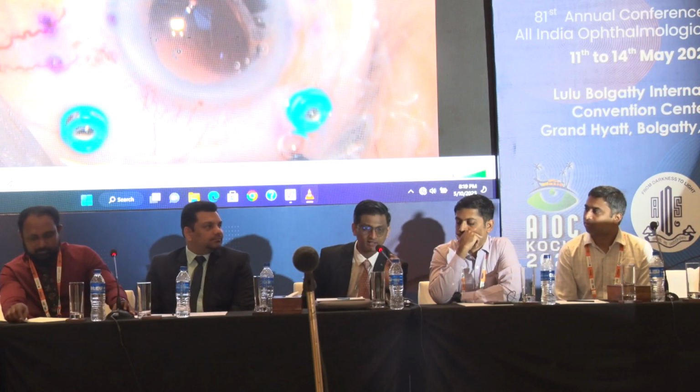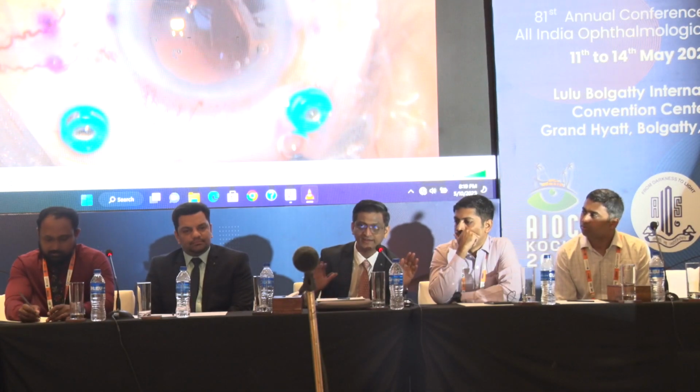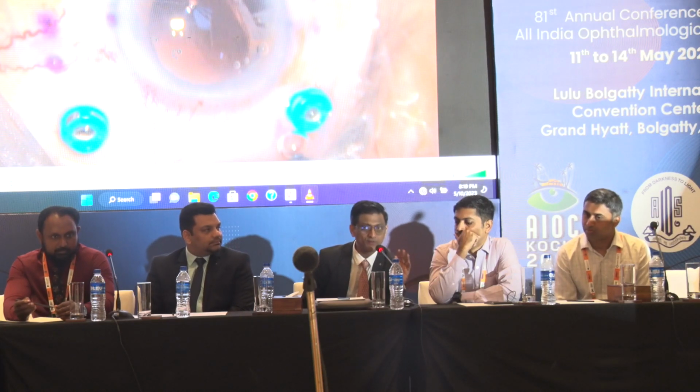Just to add what Dr. Nivian mentioned, if you look at all the big meta-analyses over the different techniques, outcome wise there is actually not much difference. But the problem is those anecdotal cases where you have badly done iris fixated lenses, and when you look at the slit lamp, you have a little bit of cringe in your mind. Those are the cases which are never talked about in real life scenarios. So that is where elective iris claw IOLs is something very questionable, but there are situations where all these techniques need to be used whenever necessary.